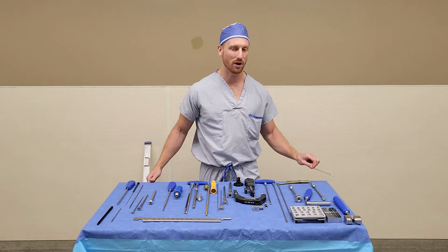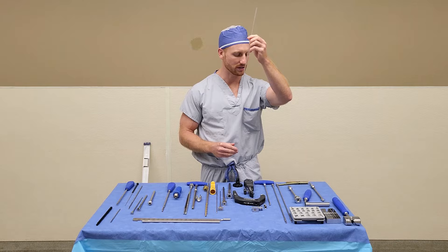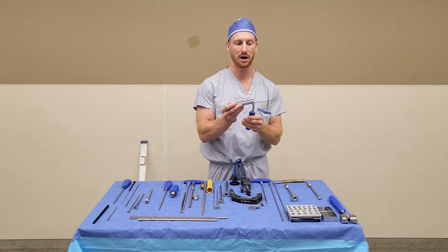Step one, you need your guide wire. The surgeon will use this to create their starting point. After the guide wire, you can hand up the soft tissue protector, which will go over the wire.